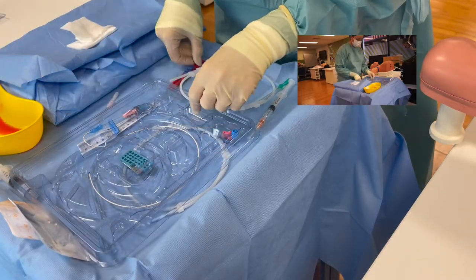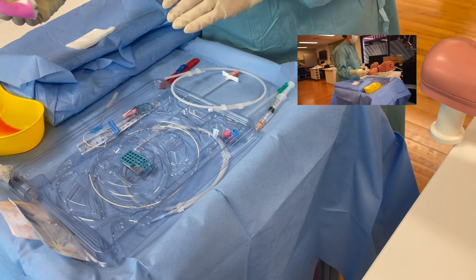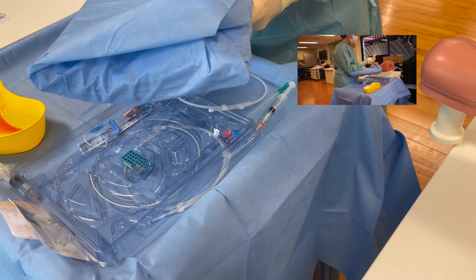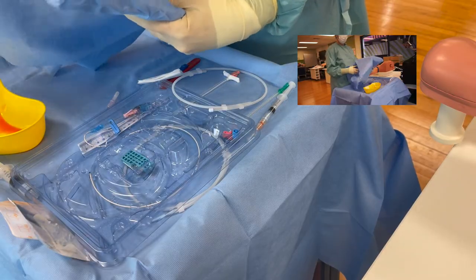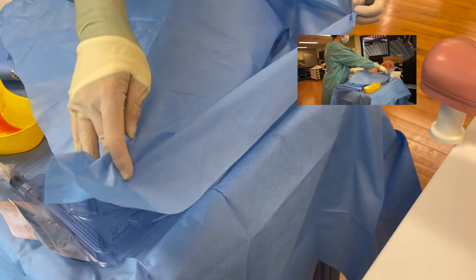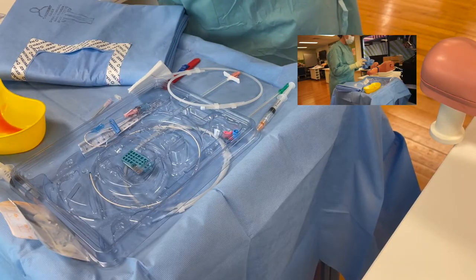At this point you can go ahead and take some chlorhexidine. If your patient is able to move their arm, you would ask them to lift their arm and clean the posterior of their arm. When you've cleaned the posterior of the arm, you would discard your dirty cleaning stick, unwrap your fenestrated drape, keep that safe, and then place it underneath the patient's arm and get them to lay their arm down straight with the palm facing up. Because the training arms don't lift up, we're going to skip that step.